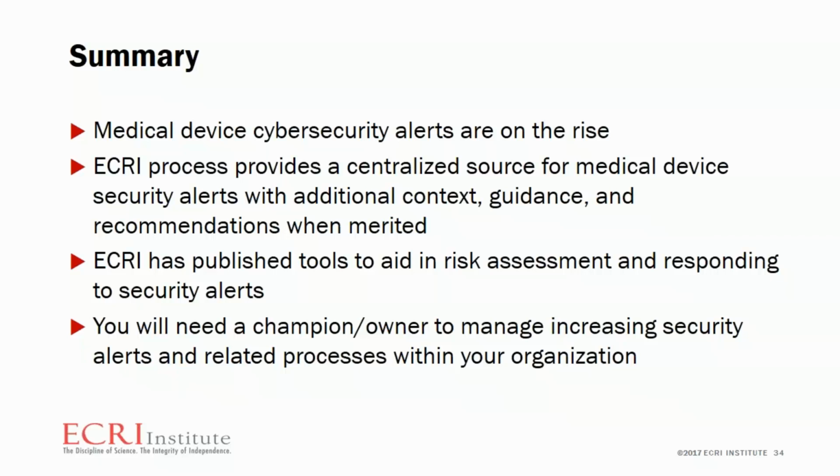ECRI has also published some tools that can help you in responding to these security alerts, as Chad outlined, some of the matrices that can help you assess the risk. This is, again, as a guidance article available also through the Cybersecurity Essentials. We want to take a look at that. And finally, it is paramount to have a champion or owner who is going to manage this increase in alerts and the related processes for your organization.